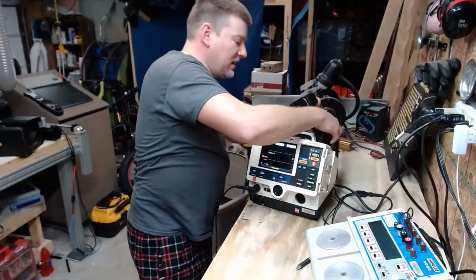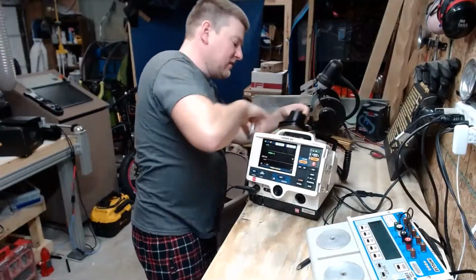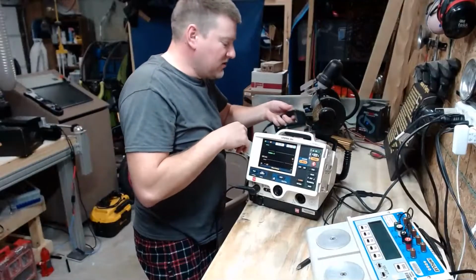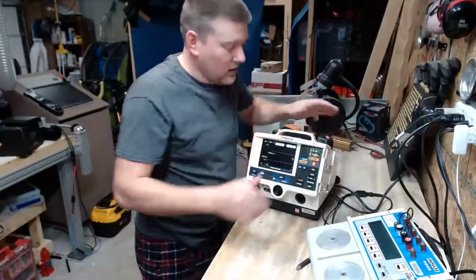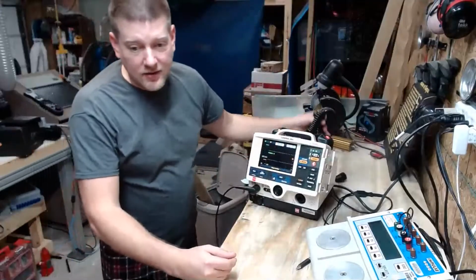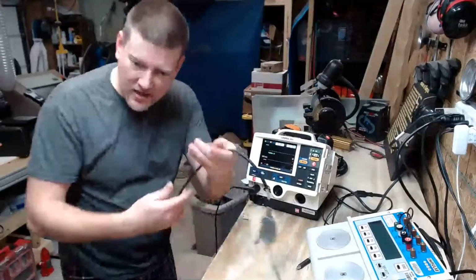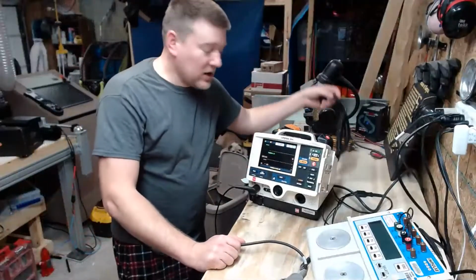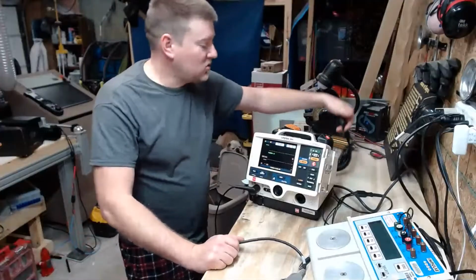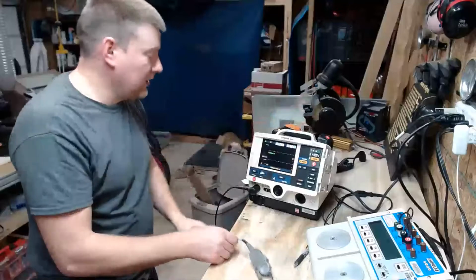Now, the only other thing that's very important is when you are done with your tests, make sure that your paddles are stowed correctly. The users almost never have the paddles plugged in. They always use it with this cable here. Never with the paddles, almost never. But make sure that the cable isn't tangled up. Make sure it's nice and organized, that your paddles are actually connected properly. All right.